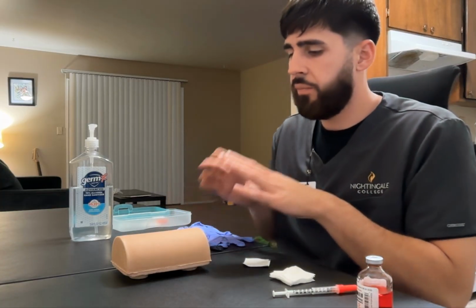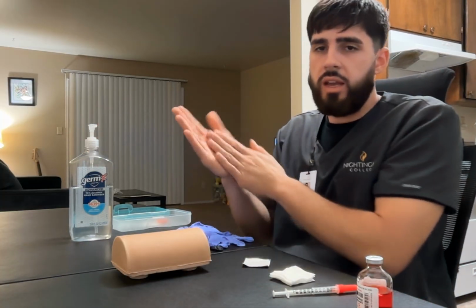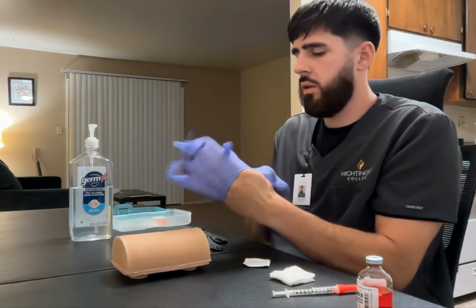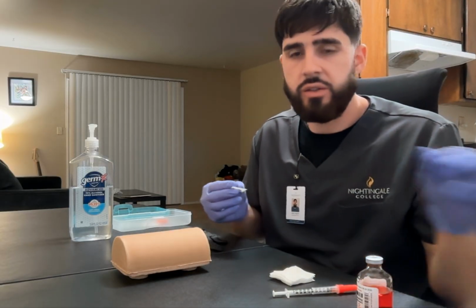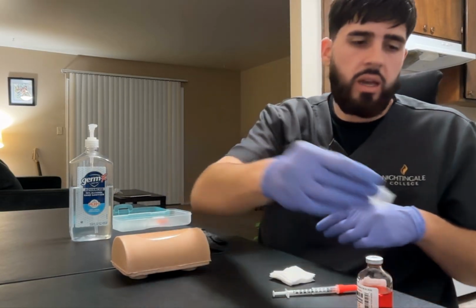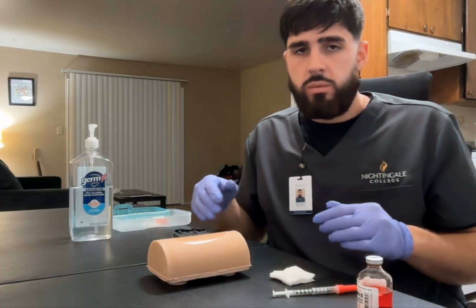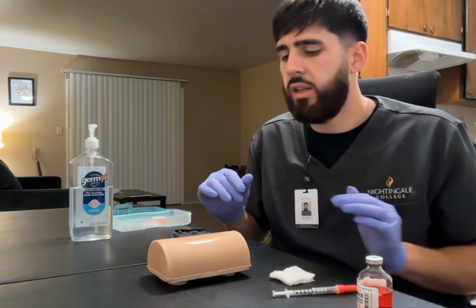Now I need to clean the injection site before administering the medication. For that, I'm going to, of course, apply hand hygiene and don a set of new clean gloves. I'm going to open an alcohol prep pad and clean the injection site, starting from the center and working outwards about 2 inches. Okay, we'll throw that away. I'm going to let that air dry. Make sure not to blow or wave my hand above the injection site to speed up the process of that. I'm going to go ahead and let that air dry.